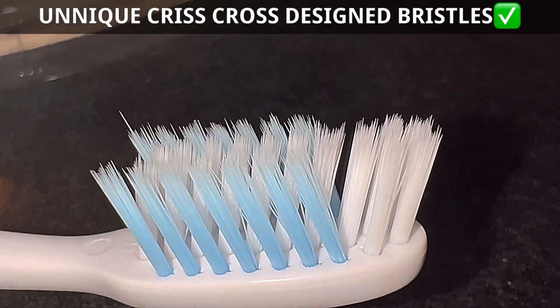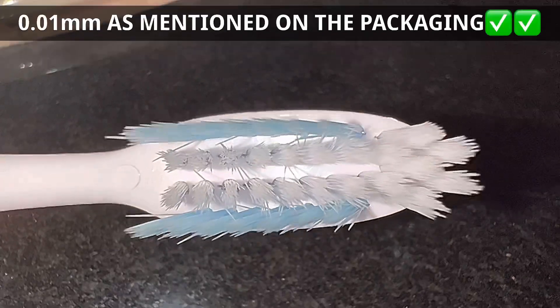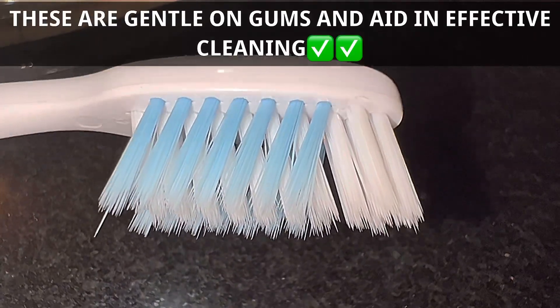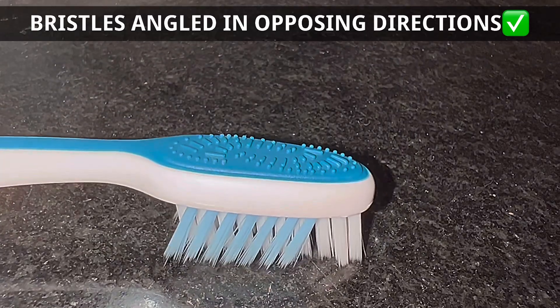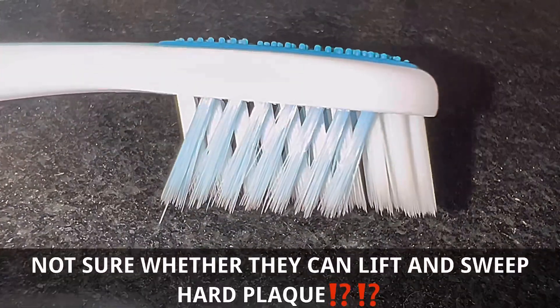The unique design of these bristles — they seem to be pretty thin and as mentioned on the packaging, they are 0.01 mm, and of course they will be gentle on the gum and useful in deep cleaning. Now look at the crisscross design of these bristles — these are unique crisscross bristles.